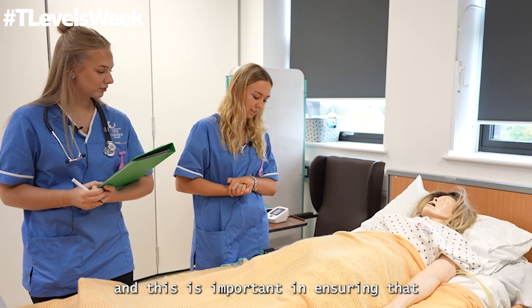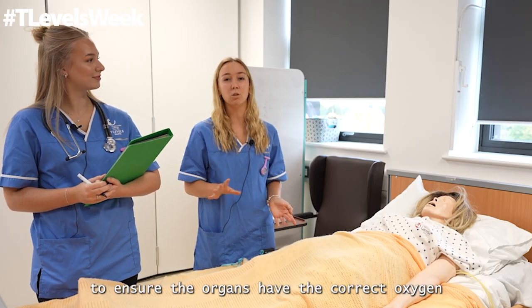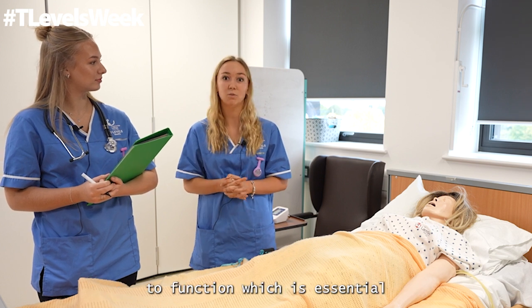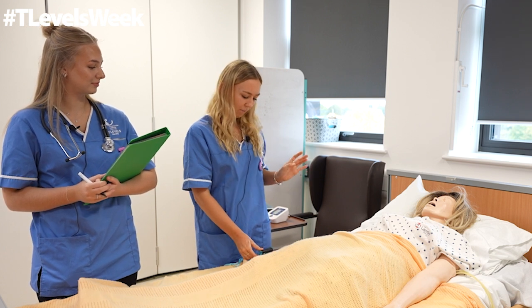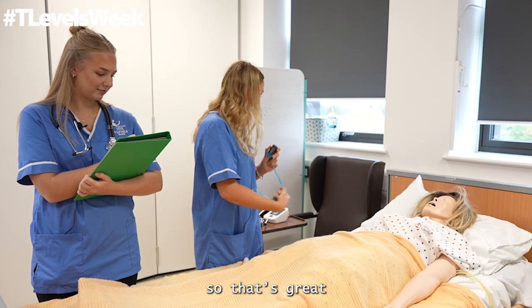And this is important, ensuring that the oxygen is flowing all around the body to ensure the organs have the correct oxygen to function, which is essential. Perfect. So Susan's is 97%, which is what we're looking for, so that's great.